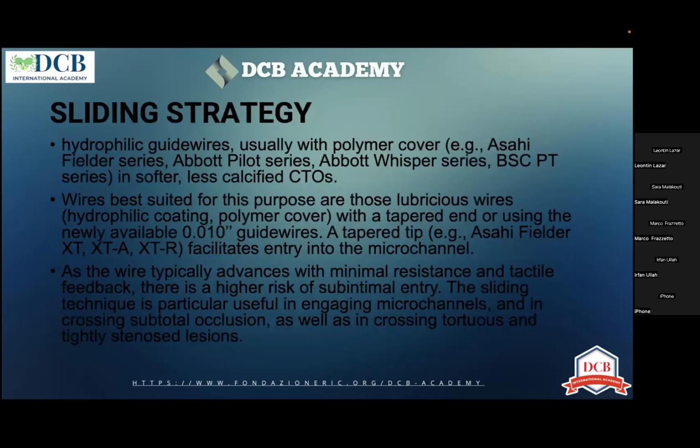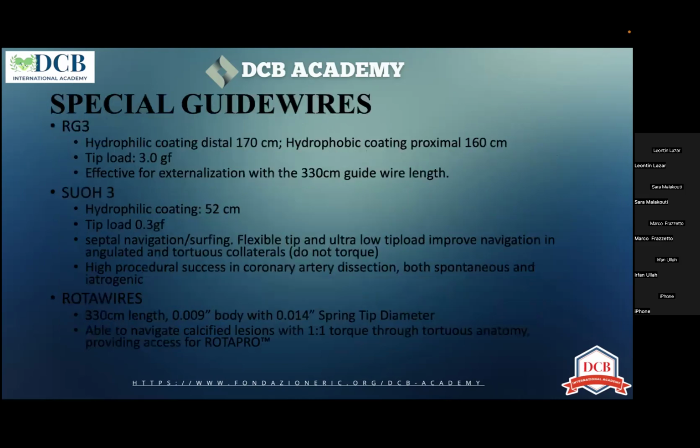And the third strategy is the sliding strategy, in which we usually use hydrophilic guide wires with polymer covers, such as the Fielder series or Pilot series or Whisper from Abbott, and so on. They have to be lubricious wires that go into the channels, and they slide into the microchannel.